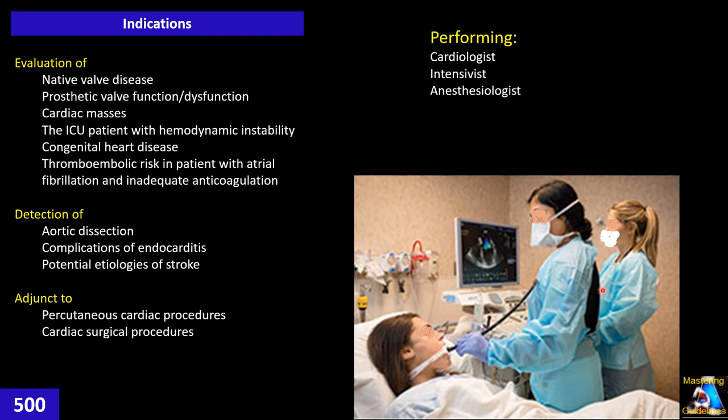But it depends on the preference of the doctor. Some doctors prefer to stand on the left and the tech stands on the right, with the machine on the right, and they watch it straightforward. Some doctors approach from the right side of the patient. It's just a matter of preference.